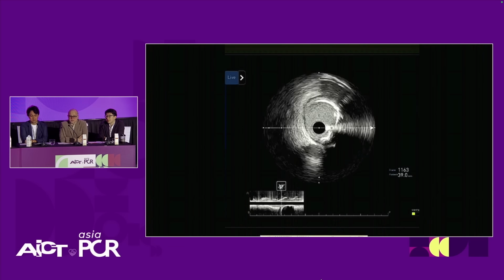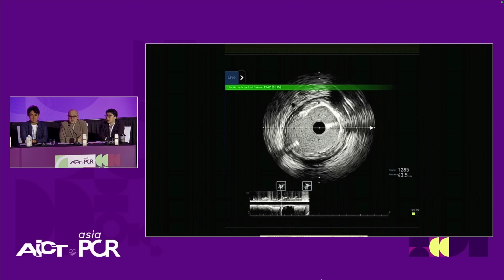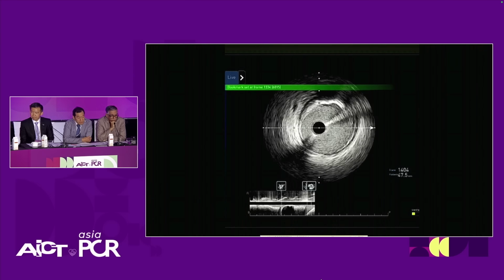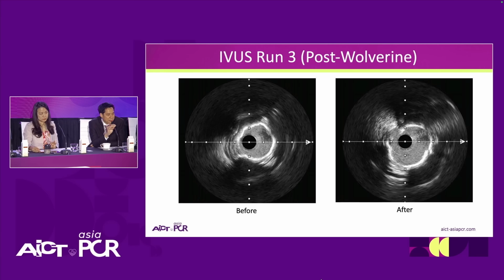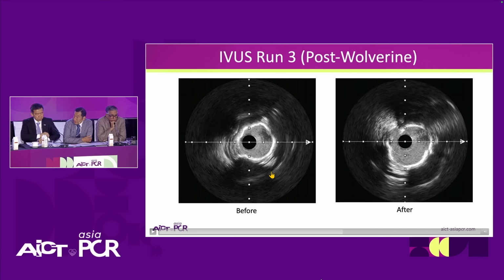And I think that really gives us confidence now, seeing these cracks. Dr. Narate, is it ready for DCB or DES? Yes, it is very beautiful. I think we are ready. Yeah, ready? Okay. Mark, let me just pause here.